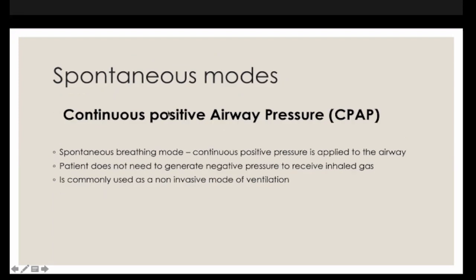So lastly, the spontaneous modes I have already discussed in my previous slides about continuous positive airway pressures. This is one of the spontaneous breathing modes that we commonly use. You can see the patient does not need to generate a negative pressure, because it has a continuous positive airway pressure, and it is also one of the commonly used non-invasive ventilatory modes.